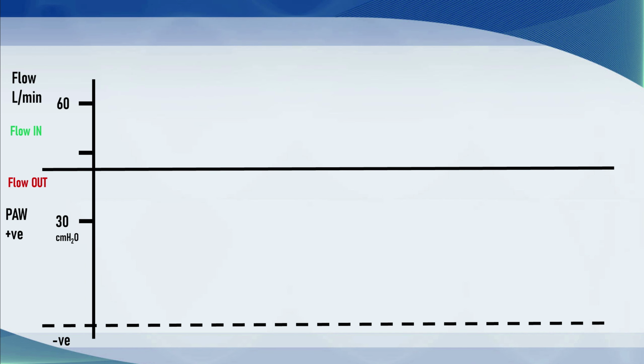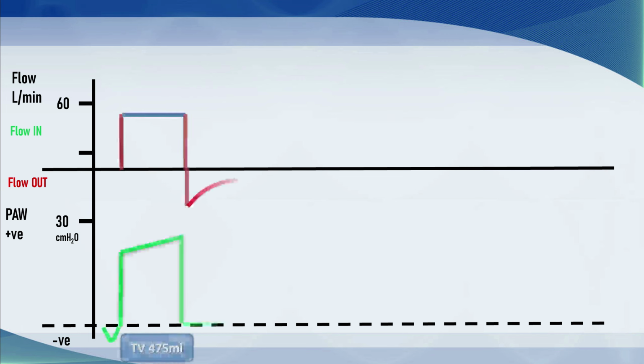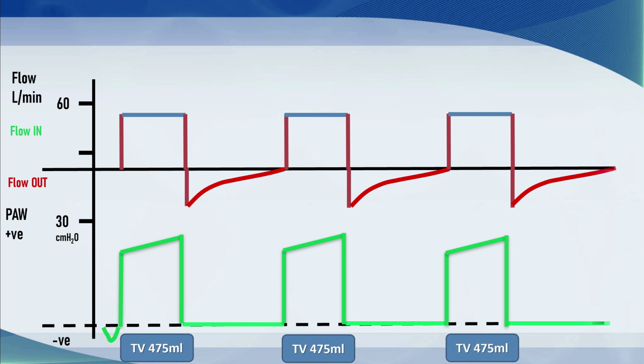Have a look at these flow and pressure waveforms, and think about this for a second. What is the first thing that strikes you about these waveforms? And then the second thing that strikes you? And then the third. So pause the video for a moment. Just look at the waveforms and the data that's in front of you and tell me how much you've learned from the first 4 tutorials.